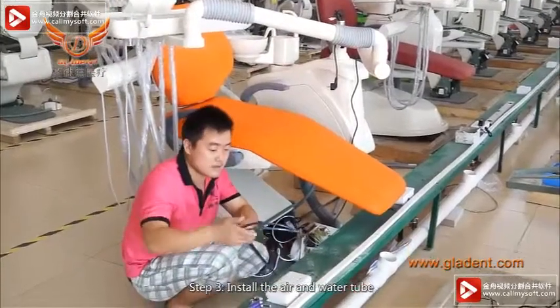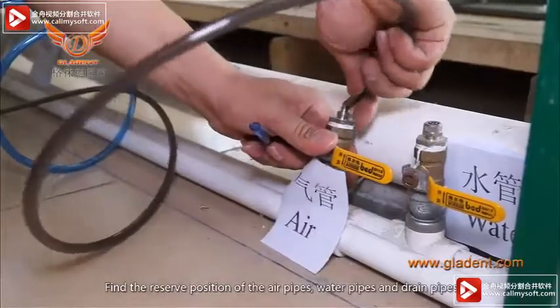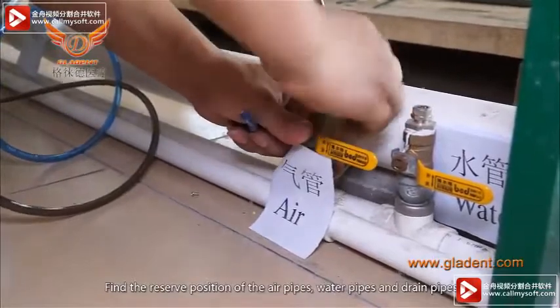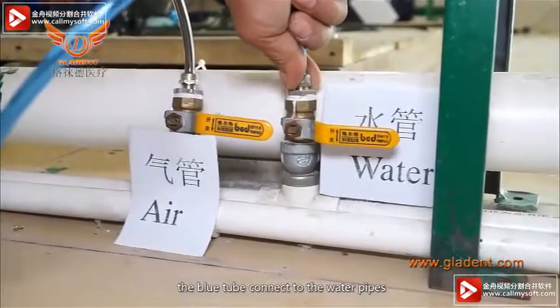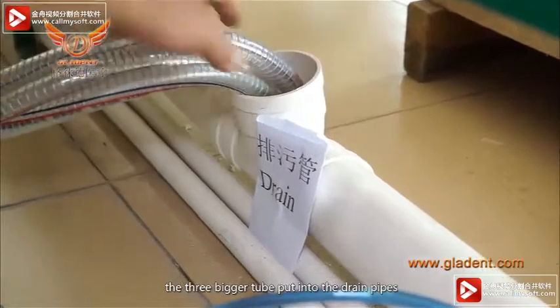Step 3. Install the air and water tubes. Find the reserved positions of the air pipes, water pipes, and drain pipes. The gray tube connects to the air pipes. The blue tube connects to the water pipes. The three larger tubes go into the drain pipes.